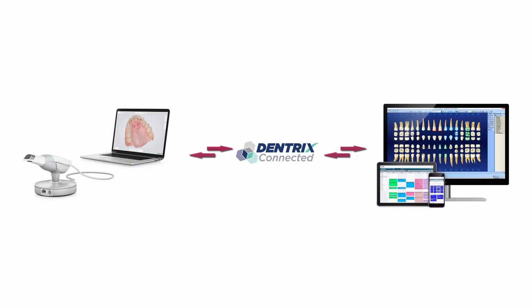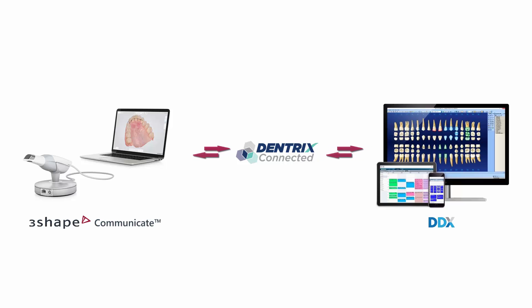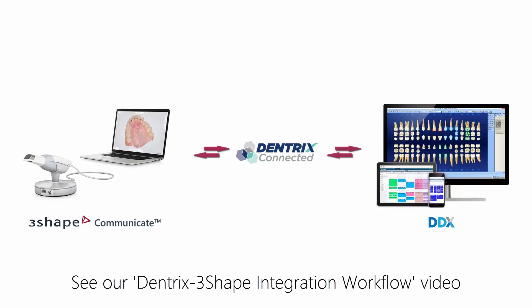The integration is powered by DDX and 3Shape Communicate. For information about how the integration works, please see the specific workflow video.